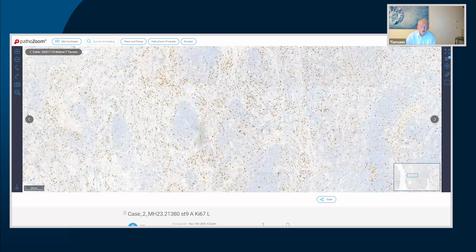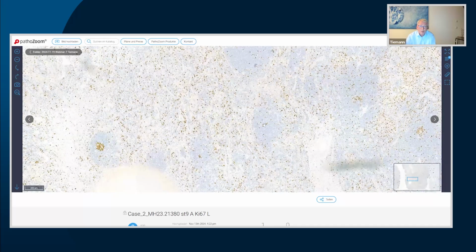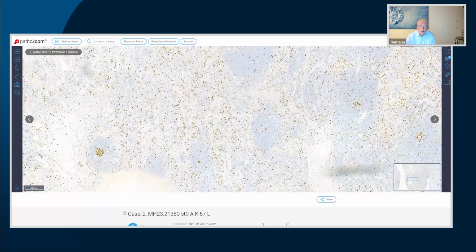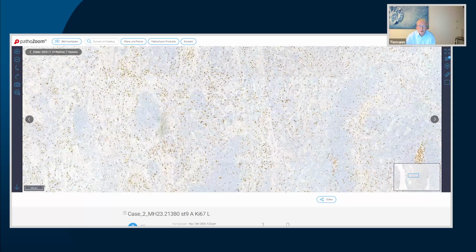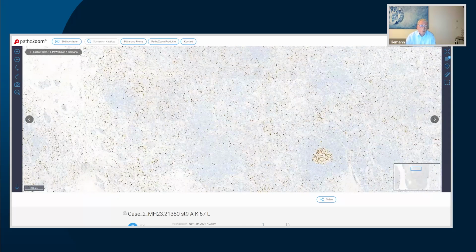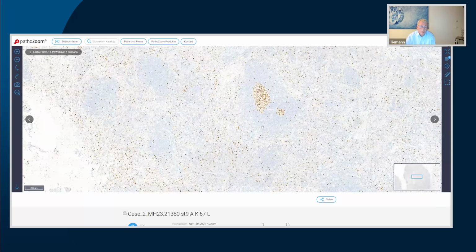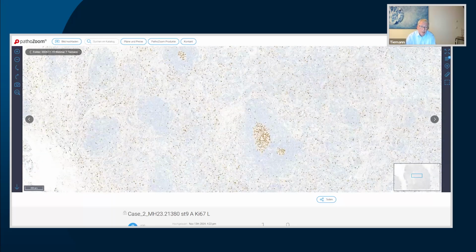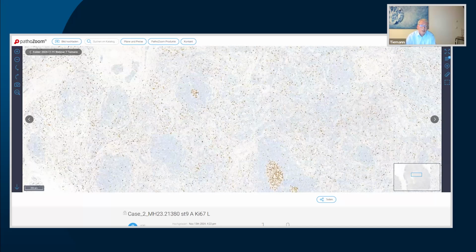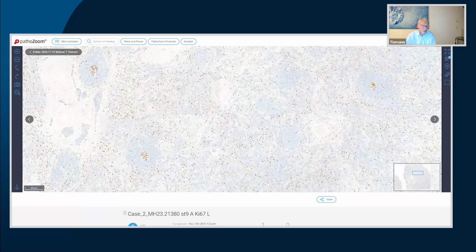no proliferation, no strong proliferation within the germinal centers. Only here, a small one, but here not. Here also not. So it looks different. Here's a little bit of proliferation. Here's more or less. Here's not normal, because the layers are missing, but here is regressive change. So it's, of course, changed. We have to keep that in mind.